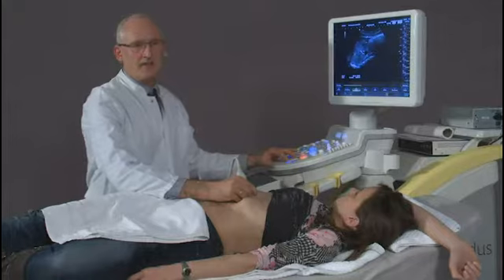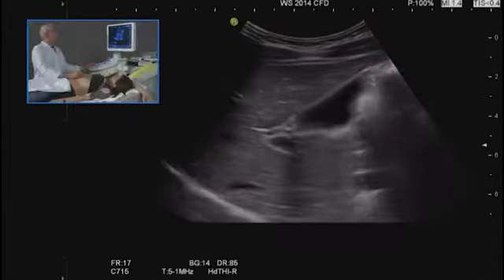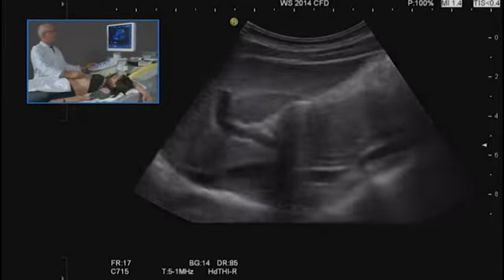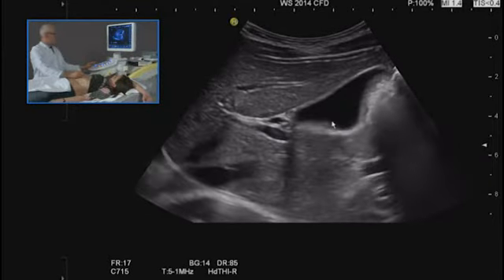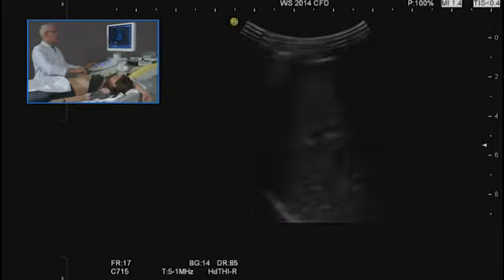The gallbladder is best examined. Take a deep breath. From subcostally as described. During a night shift under stress situation, breathe normal.